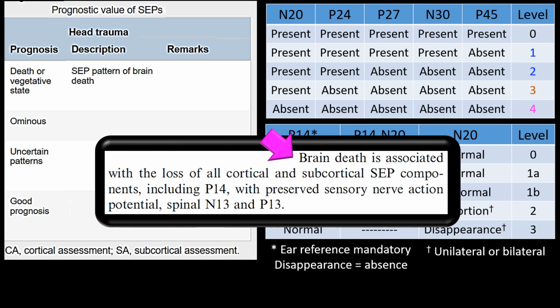Brain death is diagnosed based on the absence of cerebral and brainstem clinical function supported by an isoelectric EEG and at times also supported by the absence of cerebral and brainstem potentials after somatosensory evoked potential of the median nerve. All this, that is the use of the somatosensory evoked potential as a confirmatory test of brain death, has to be done only in those cases that the study is technically sound. The soundness of a study is confirmed by the presence of peripheral nerve potential with or without spinal potentials.